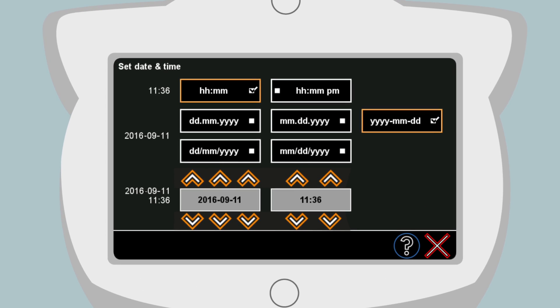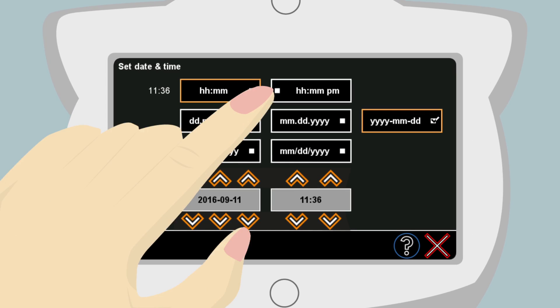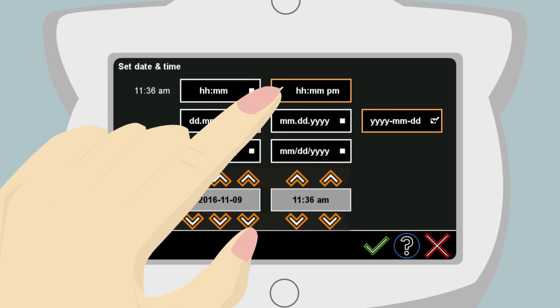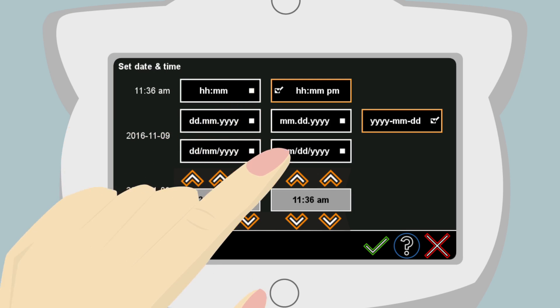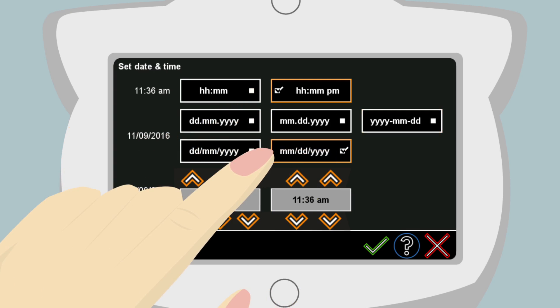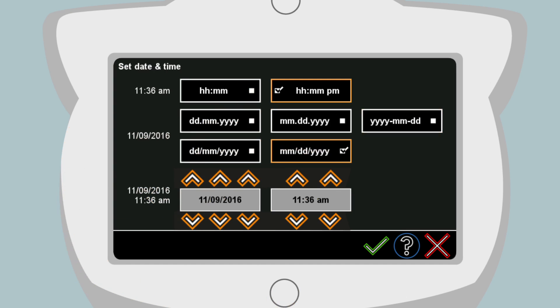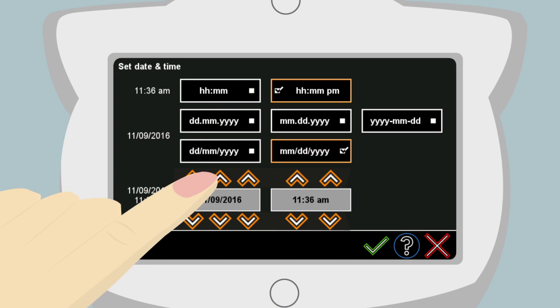The initial screen asks Anna to set the date and time. Here she simply touches the hour, minute, PM selection. Then she touches the month, day, year selection.